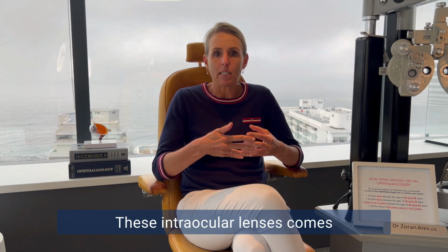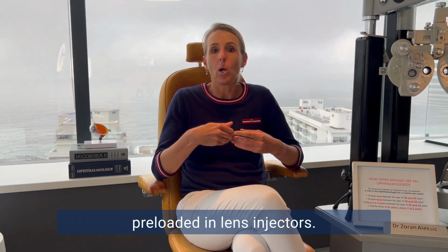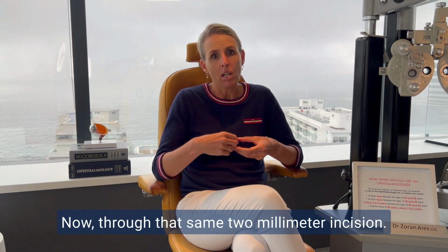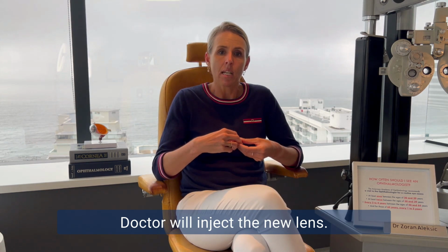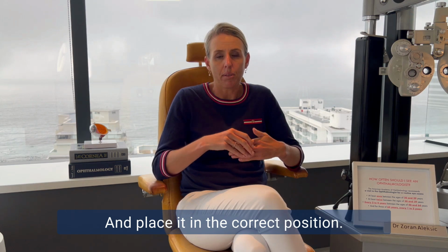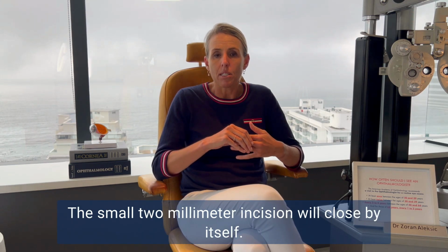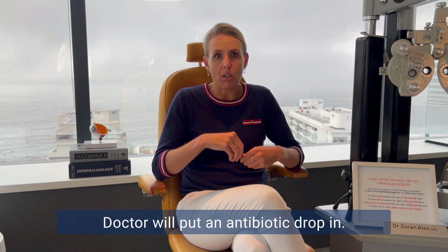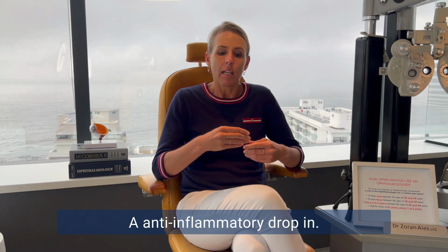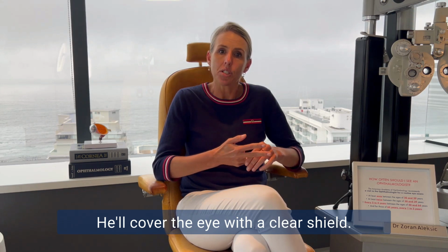These intraocular lenses come pre-loaded in lens injectors. Now, through that same 2mm incision, the doctor will inject the new lens. He will unfold it and place it in the correct position. The small 2mm incision will close by itself. The doctor will put an antibiotic drop in and an anti-inflammatory drop in. He'll cover the eye with a clear shield.